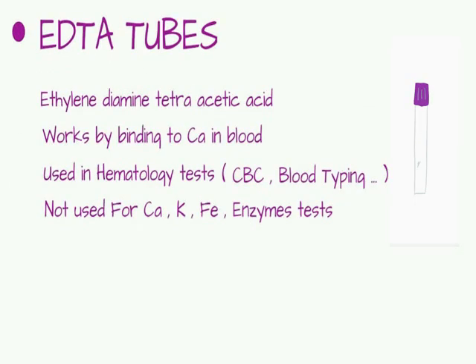Let's start with EDTA tubes. It's the one right here with the lavender cap, and yes, I have drawn that. I'm still a beginner. EDTA stands for ethylene diamine tetraacetic acid. It's an anticoagulant that is considered a chelating agent, which means it has the ability to bind to metals like calcium or iron. And that's how it prevents blood from coagulating and forming a clot, by binding to calcium, which is factor 4 in the coagulation cascade.